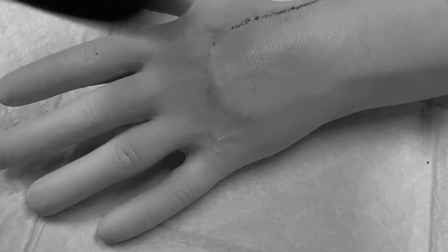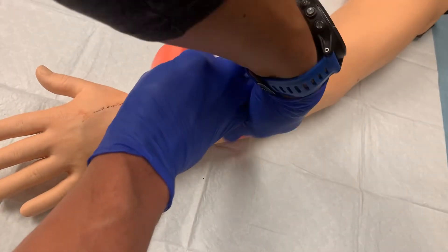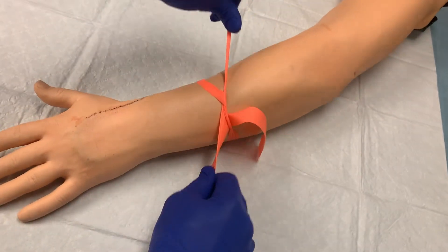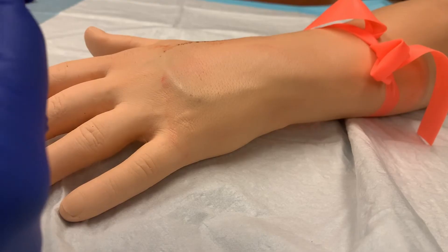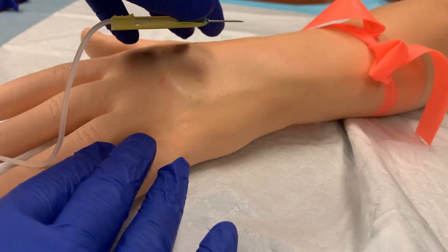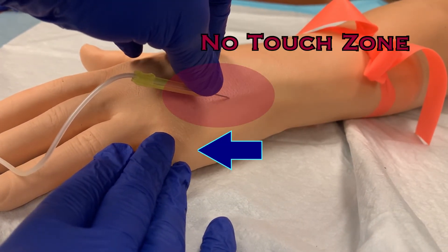Once disinfected, do not touch the site again — that will contaminate your site and you will need to clean it again. Reapply the tourniquet. Grasp the butterfly by folding the wings together. You should be holding the textured side of the wings, and if you are, the needle will be in the desired bevel-up orientation. With your other hand, you can anchor the vessel by pulling the skin down below the site, but be careful not to touch the area that you just disinfected.